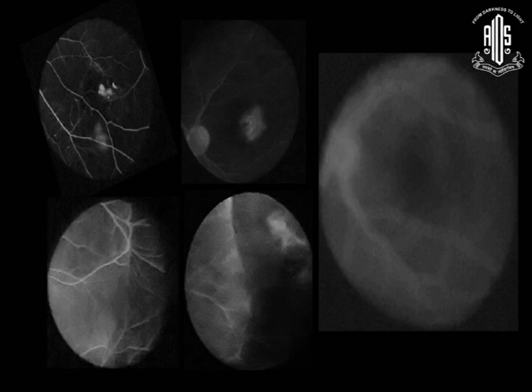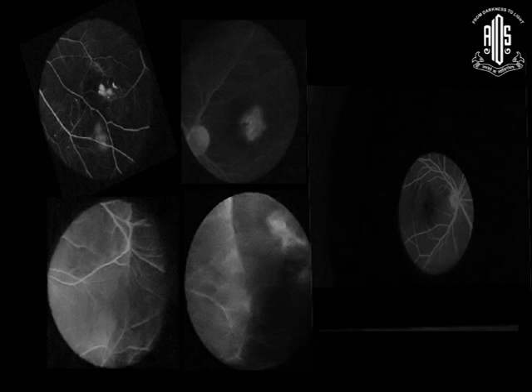This was an interesting patient. He came with macular edema and was treated elsewhere many times with Avastin. But when I looked at the macula, I knew that it was not a macular problem. It could be something in the periphery. He had received macular laser also. And we did the angiogram on the Visual Cam also, but couldn't get up to the area of interest in the periphery. So this is the eye. You can see the stippling coming in.